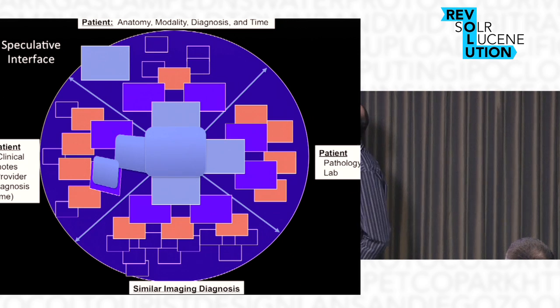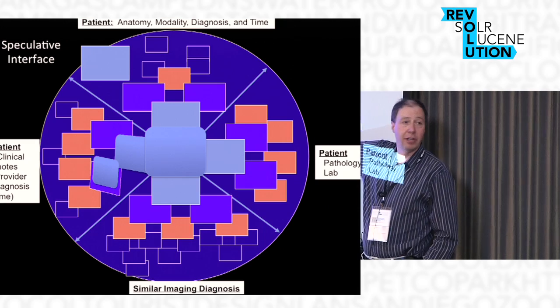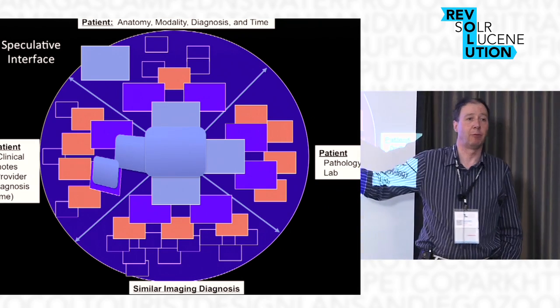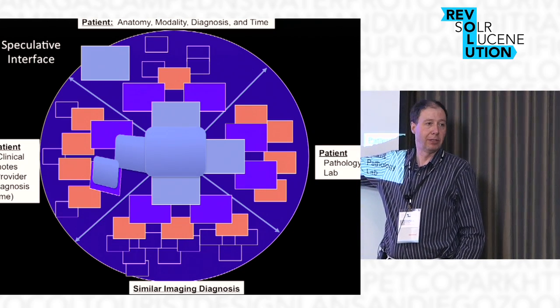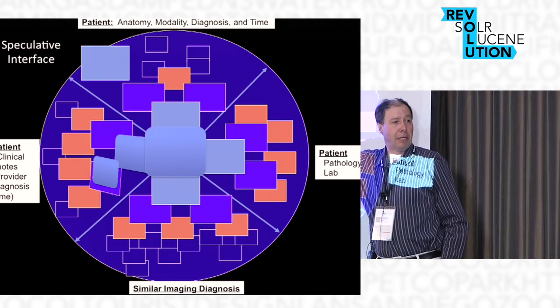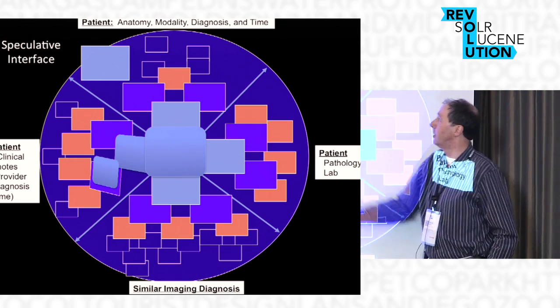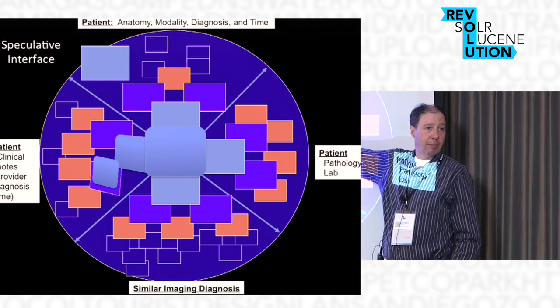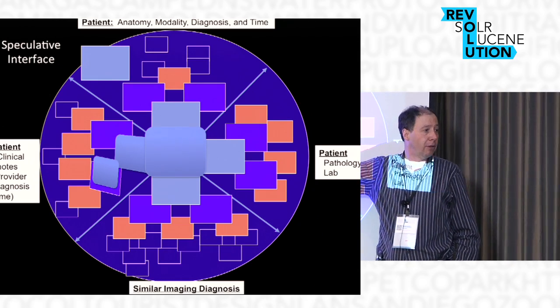So there's really 4 categories of data that we're looking at. If you would imagine the center image that the radiologist is looking at, there's a whole bunch of patient-specific information. If we're looking at how well the tibia is healing, we might have pictures of the tibia in earlier stages of the healing process that's specific to that patient. Then we also have other information about that patient that is not necessarily the clinical notes or images.